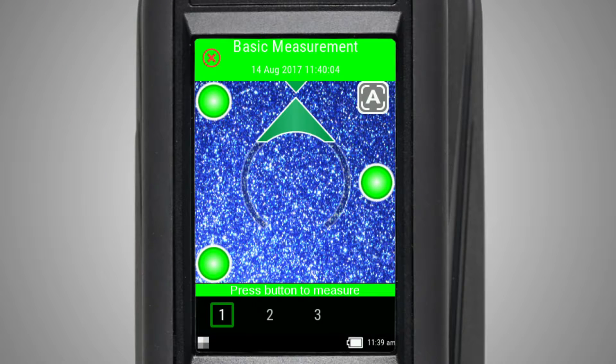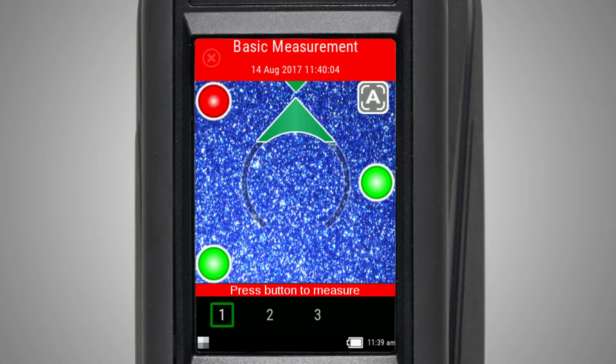The screen will also display an image of the sample along with three indicators representing the pressure sensors. If all three indicators are green, it indicates correct pressure being applied to your instrument. If one or more are red, it indicates that the correct pressure isn't being applied to the corresponding sensor.